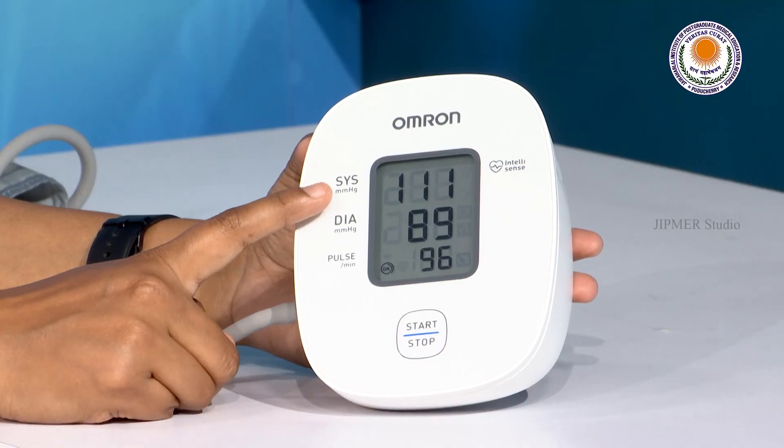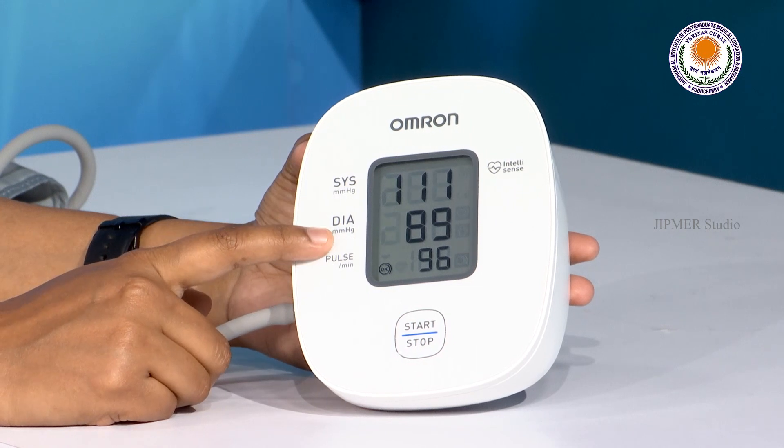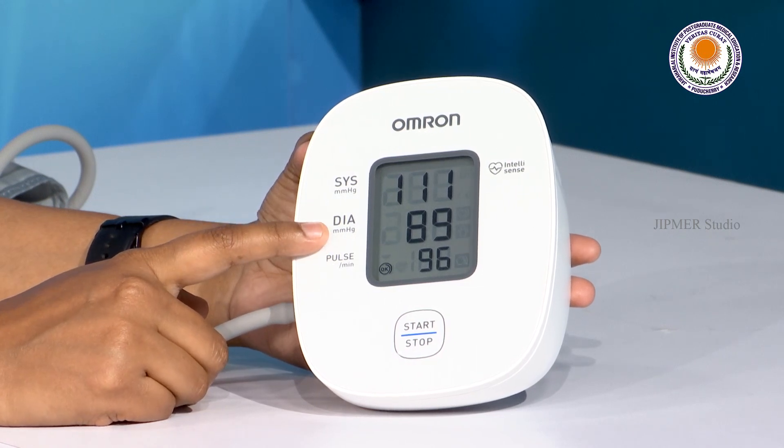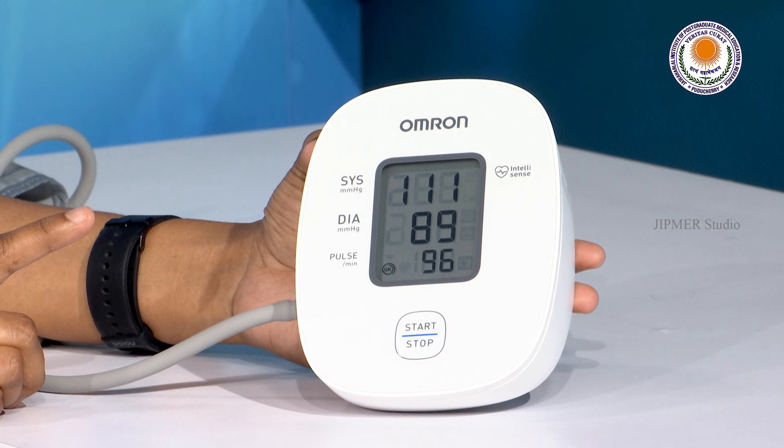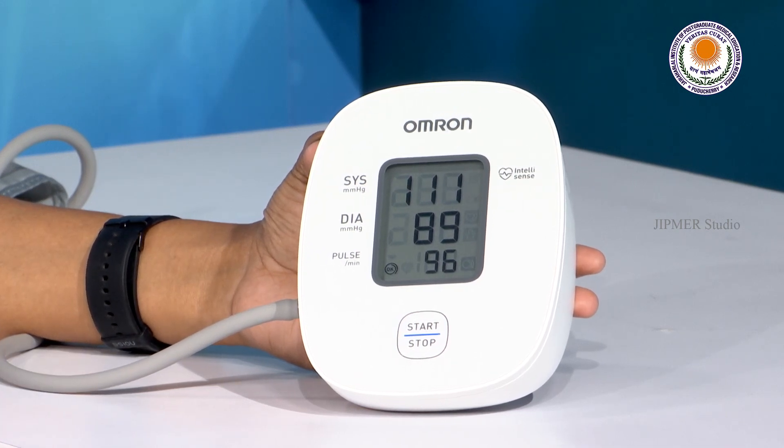After a few minutes, you might take a second reading because the first reading is often high. Your blood pressure monitor screen will show you the upper blood pressure value, which is systolic, and the lower blood pressure value, which is diastolic. As a general measure, blood pressure values should be less than 140/90 and more than 90/60.